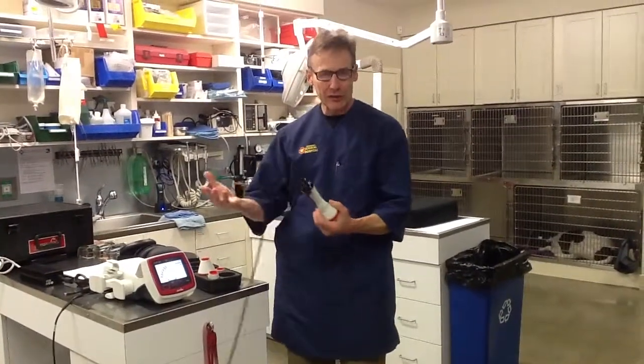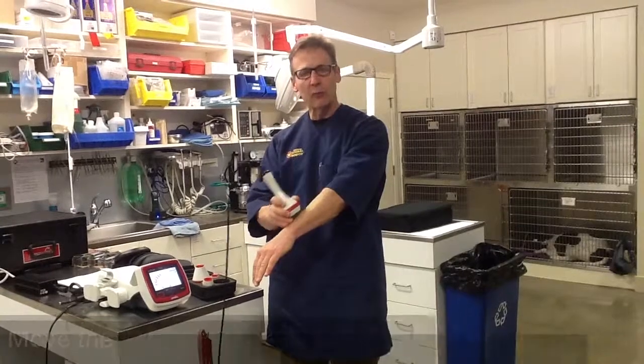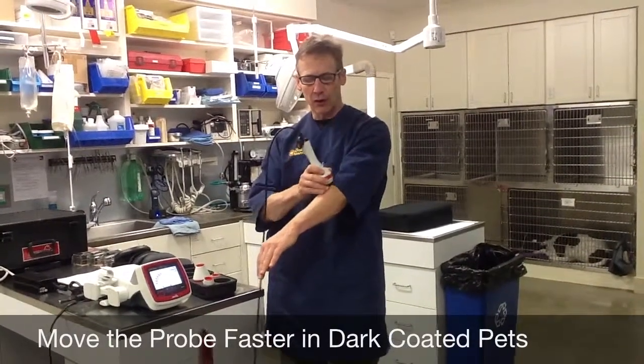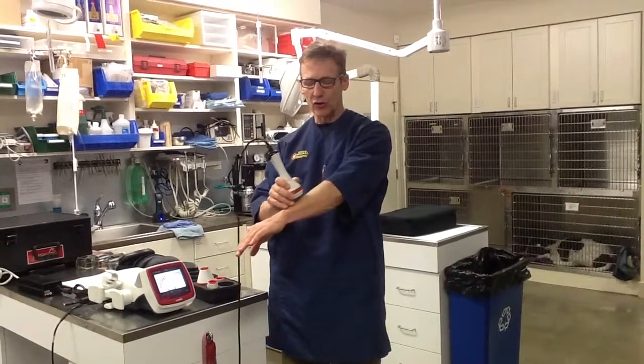Why would you want to move at 3 inches instead of 1? Say that you had a dark-skinned, dark-haired animal and it was feeling a little too warm. Then you can just move the probe a little bit faster and that will allow the tissue to cool down or stay cooler. You can also use the contact head slightly off contact — 1 or 2 millimeters away.